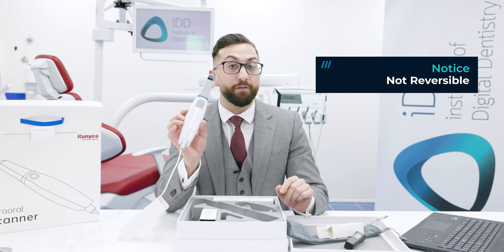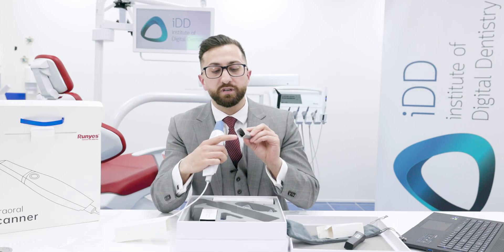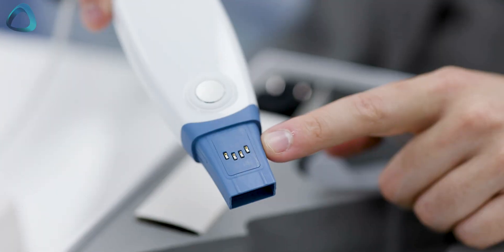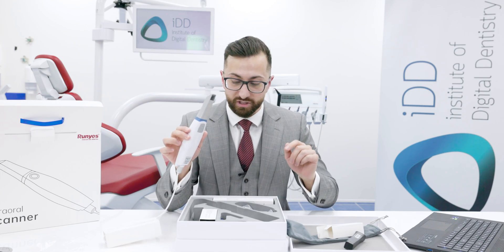These are not reversible scanner tips — they can only fit in one way. You can see this because there is a small metal chip on the tip, and that connects with a metal chip on the scanner itself. This is how the scanner software reads that a scanner tip is attached.